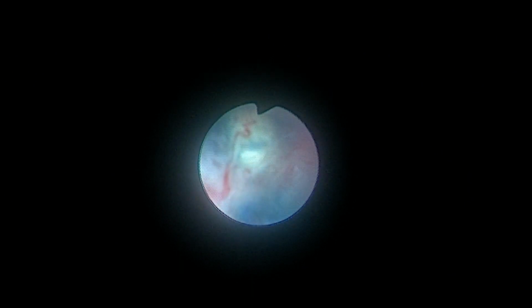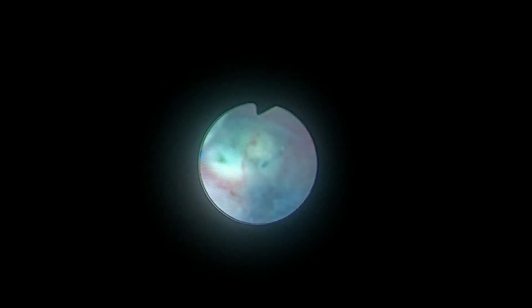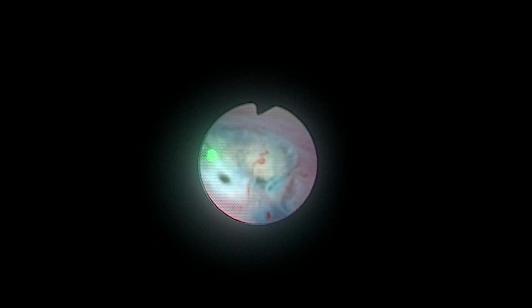Once the location of the stone was confirmed both by CM and Spritz test, we decided to open this opening with the help of laser. A thulium laser was used with power of around 20 watt to cut the diverticular mouth opening. A 200 micron TFL fiber was used for this case.